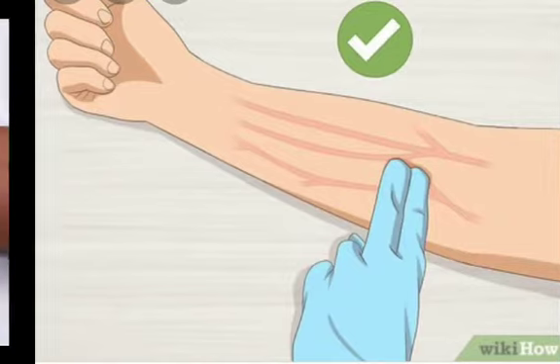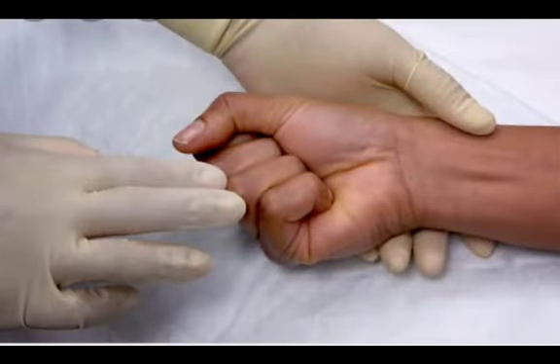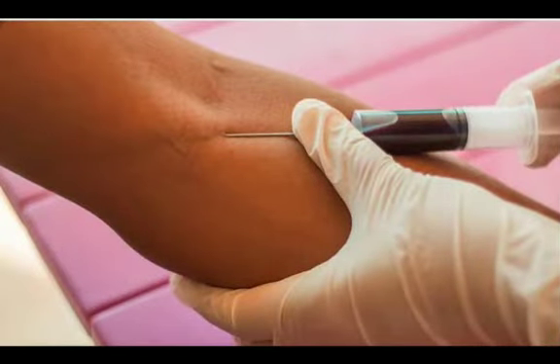Ask the patient to make a fist and avoid pumping the fist. Hold the patient's arm firmly, using the thumb to pull the skin taut to anchor the vein. The thumb should be 1 up to 2 inches below the venipuncture site. Swiftly insert the needle through the skin into the lumen of the vein. The needle should form a 15 up to 30 degree angle with the arm surface.